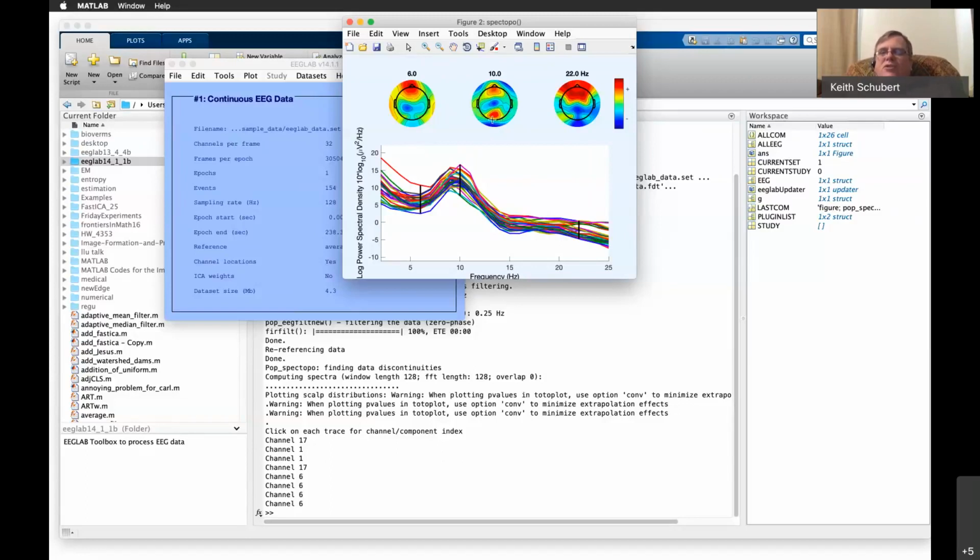That there's something going on in the prefrontal and the occipital, I'm pretty sure, but the exact area, I mean, it looks on this one like maybe that's center, maybe a little bit further over. You often get recognition on this part when you're trying to classify stuff. So it is possible that it's a little bit wider towards that classification area.